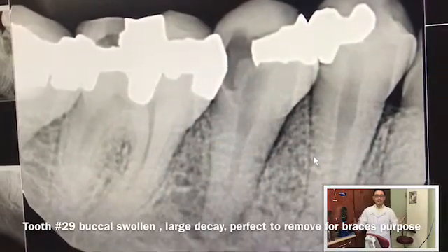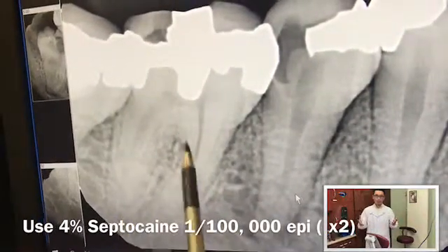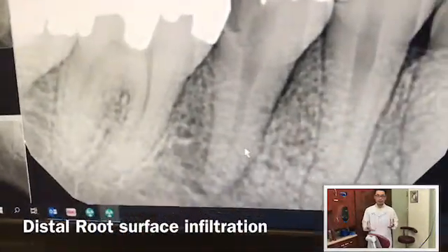In this particular case, tooth number 29 — do you think you can take out a tooth without doing an IA block? Yes, you can. In this case, I used two carpules of septocaine. I numbed around the tooth and was able to get the tooth out.